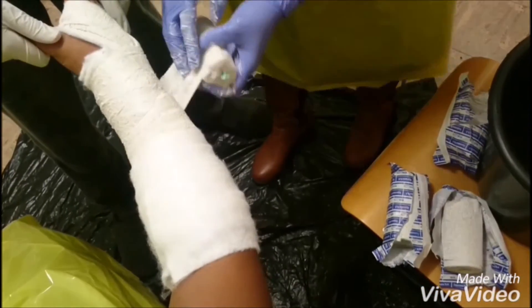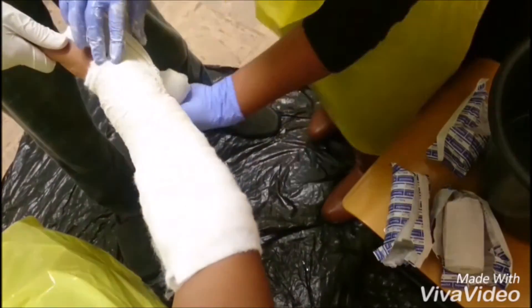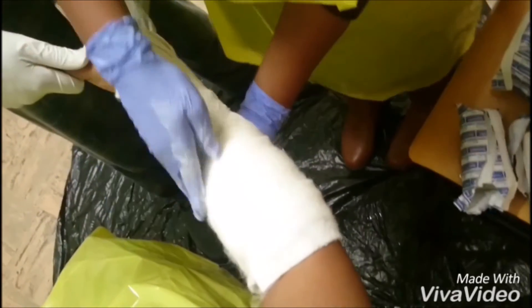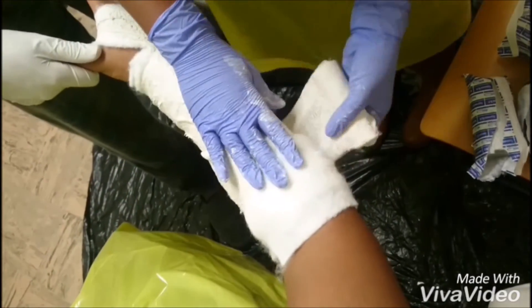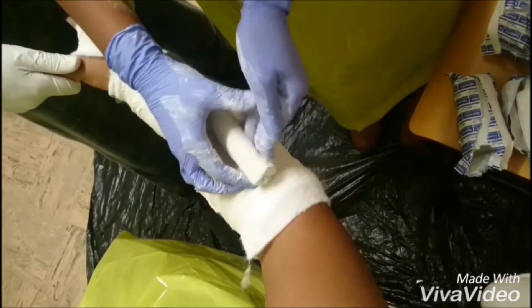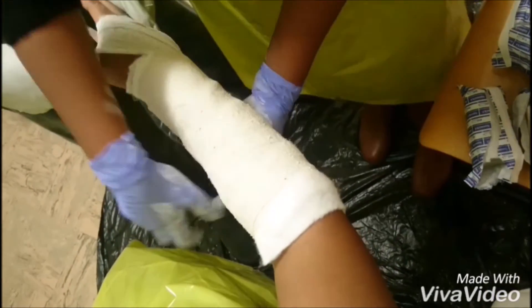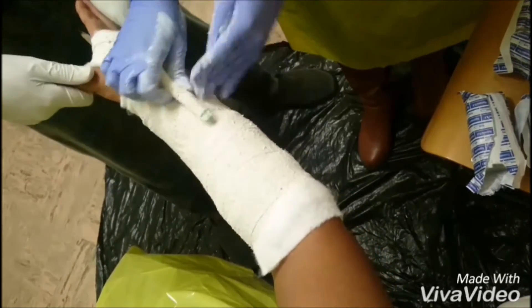When applying the plaster, ensure that the distal palmar crease, the knuckles, and the metacarpophalangeal joints are not covered by the plaster, allowing flexion of the digits. The joints at each end of the cast must be left free to move during the period of casting. Avoid extending the cast too close to the elbow anteriorly, which will prevent elbow flexion. Leave a rim of padding when putting the first layer, which will be folded over in the second layer.